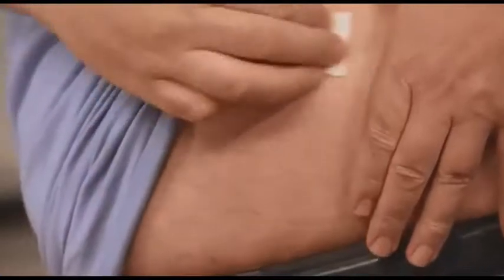Whether you're injecting in the abdomen or thigh, as part of healthy injection practices, it's important to rotate your injection sites. Move the injection down by a finger's width with each injection, and then change to a new site each week. So now, with the second alcohol swab, clean the small area of skin where you plan to inject. To clean the injection site, start in the middle of the site, and then, moving in a circular motion, clean the whole area. To reduce any stinging, be sure to let the alcohol on your skin air dry completely before you inject.